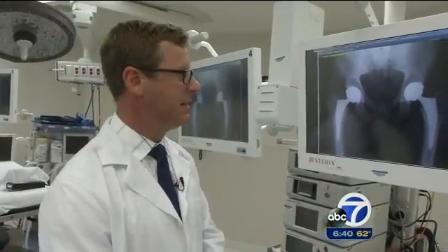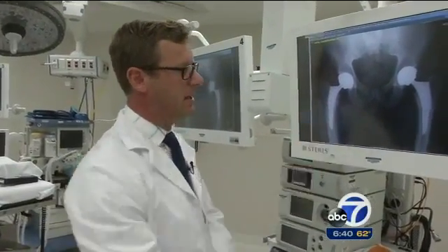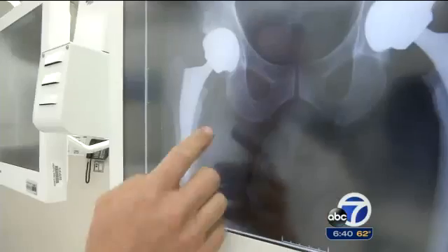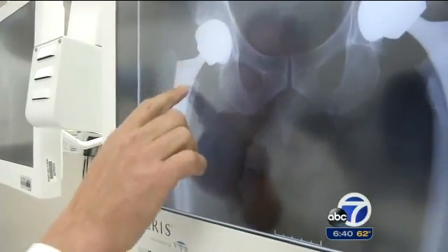Modern hip replacements are made up of a few different parts. He turned to surgeon Nicholas Mast at St. Francis Hospital in San Francisco, who specializes in an alternative procedure known as anterior hip replacement. Its proponents say it's less invasive and allows the surgeon to minimize the amount of muscle tissue cut during the operation. But probably the most important one for the patient is that there's reduced recovery time and less postoperative restrictions.